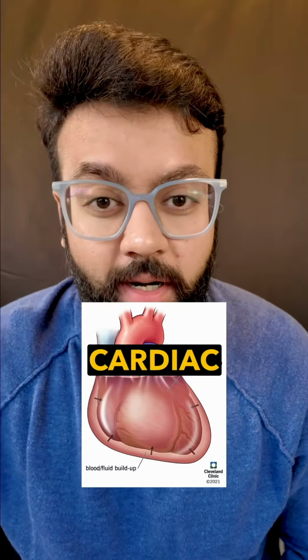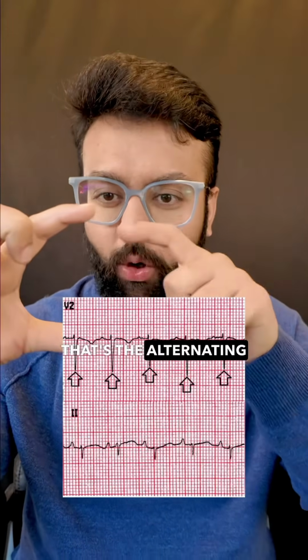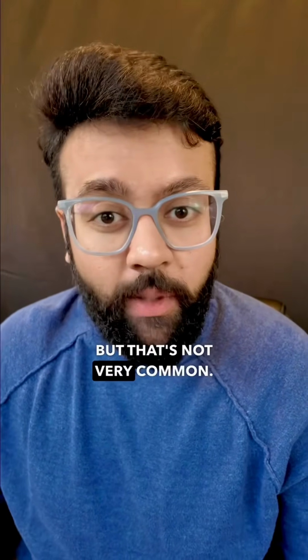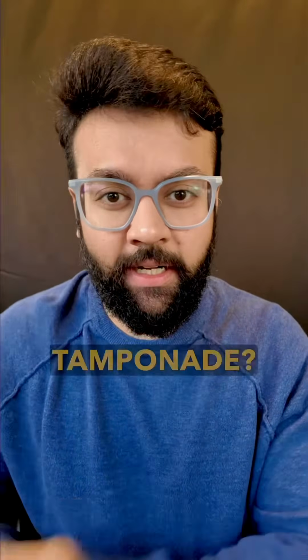Whenever we think about cardiac tamponade, the EKG finding which comes to our mind is electrical alternans. That's the alternating height of the QRS complex, tall and short. That's seen in cardiac tamponade, but that's not very common. So, what's the most common finding on EKG in cardiac tamponade?